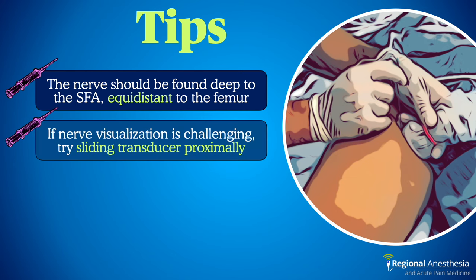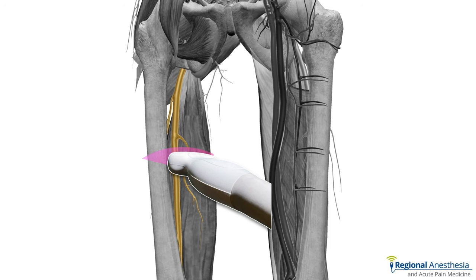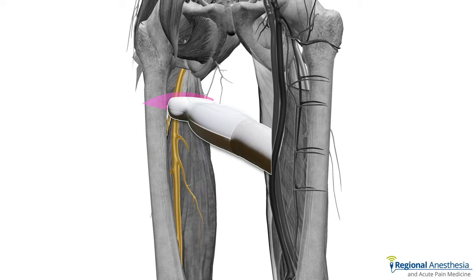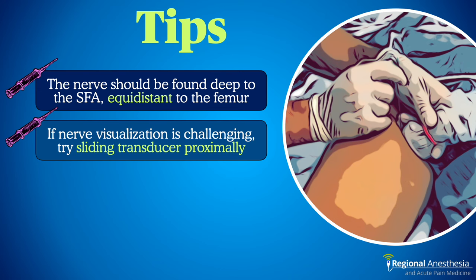Second, it's common to put the probe on the thigh and not see the nerve right away. There's a good chance the probe is a little too distal. If you find yourself at mid-thigh, slide up towards the groin to get a better view. This block is best done at the proximal third of the femur.